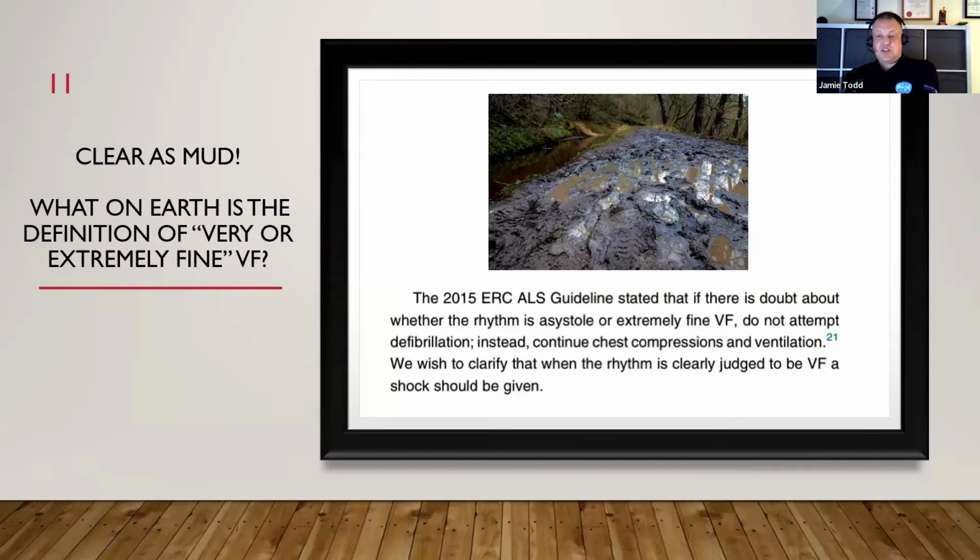And I think that's where some of the confusion comes from. People are really unclear whether they should shock these low amplitude VFs or not, because the guidelines are very, very unclear. So what is our definition? It's like these terms have been made up: fine VF, very fine VF, extremely fine VF. I'm going to need a more accurate ruler, it seems.